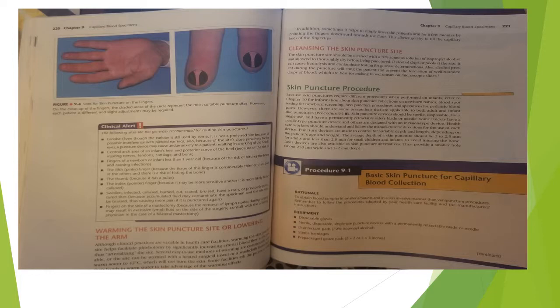Swollen, infected, callous, burned, cut, scarred, bruised, rashy, or previously punctured sites, because accumulated fluid may contaminate the specimen and the site may be bruised, thus causing more pain if it is punctured again. Fingers on the side of a mastectomy, because the removal of lymph nodes during surgery may result in excessive lymph fluid on the side of surgery. Consult with the ordering physician in the case of bilateral mastectomy.